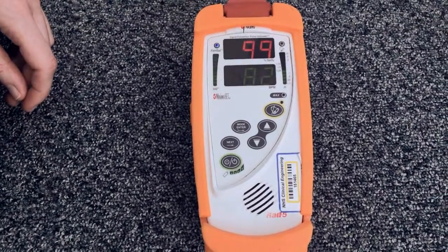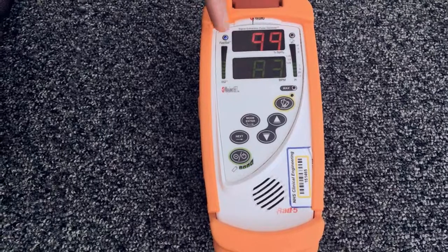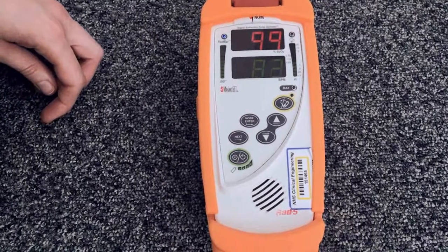In your home monitoring booklet, you will have details of your child's normal ranges for their condition. If these numbers fall outside of those ranges, please refer to the red flag section of your booklet to tell you what to do.